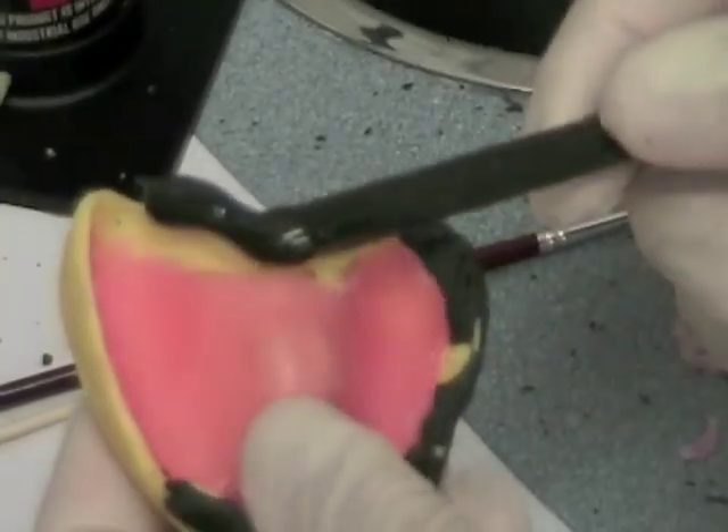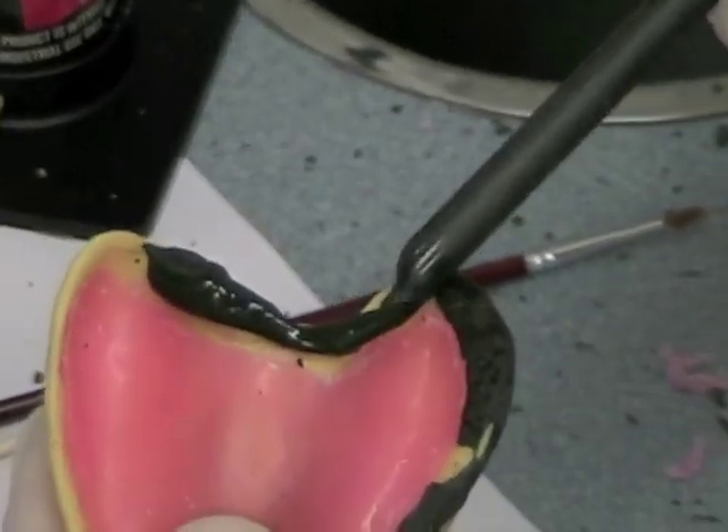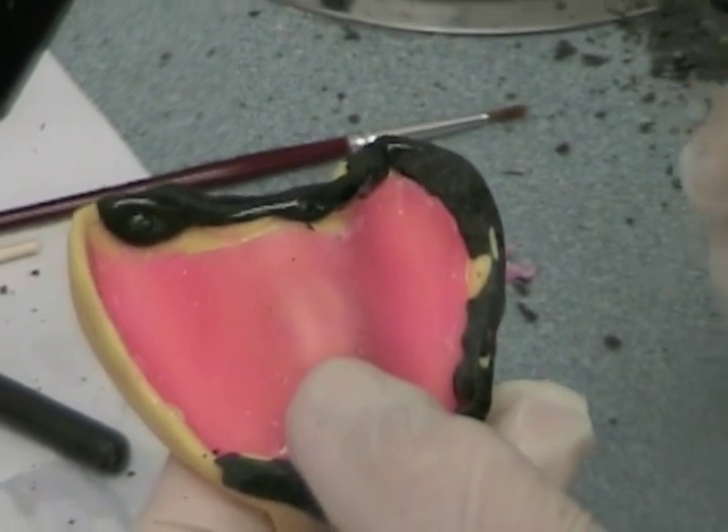Add compound to the posterior border of the custom tray — on top of the tray, not on the posterior border edge. Make sure that you don't extend past the vibrating line.